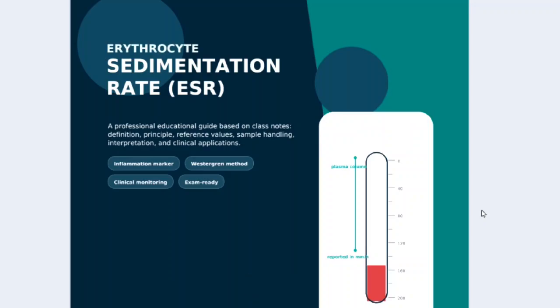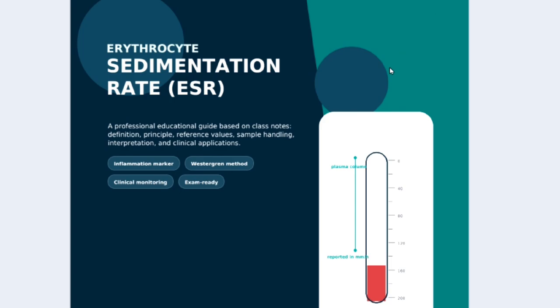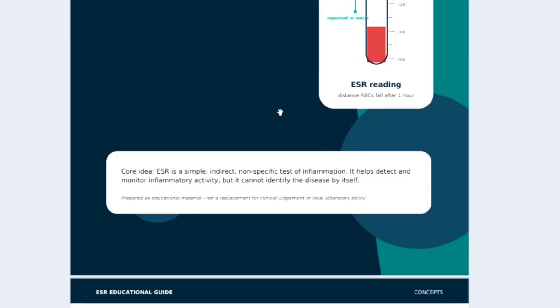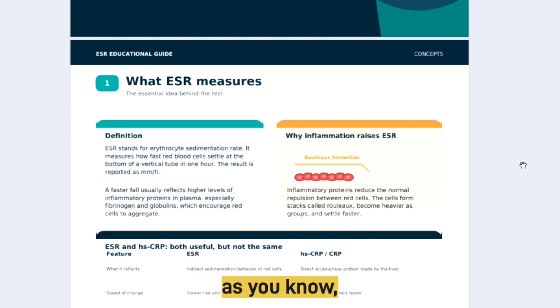Today we are talking about ESR, or Erythrocyte Sedimentation Rate. As you know, ESR is a simple, indirect, non-specific test for evaluating the presence of inflammation.